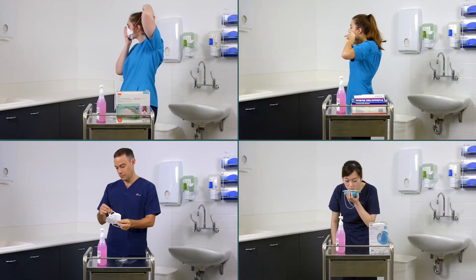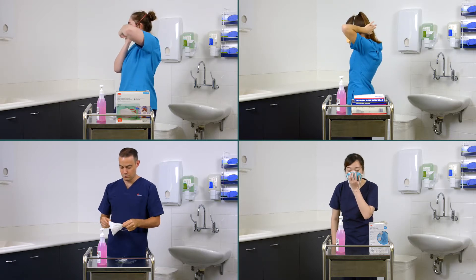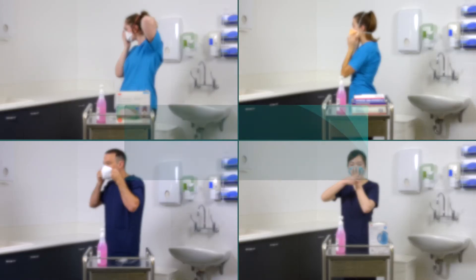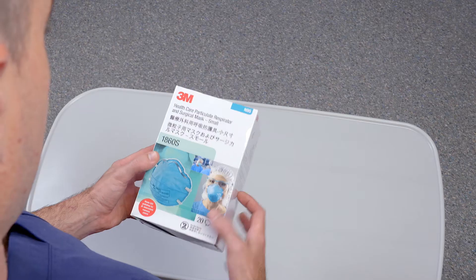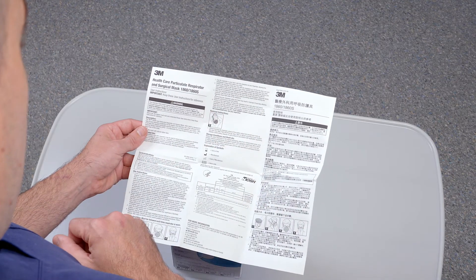This video forms part of a series on donning and fit checking P2 or N95 respirators in New South Wales healthcare settings. It is important to refer to the overview on these types of respirators for general guidance. This video does not replace the need to check the manufacturer's instruction for use.